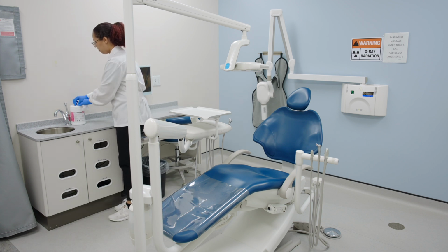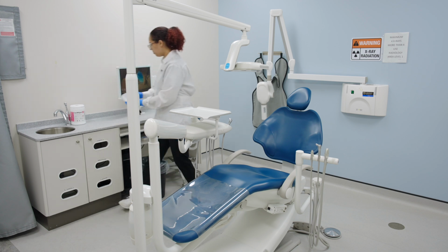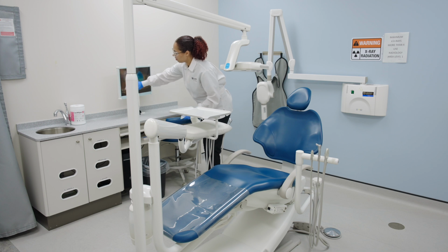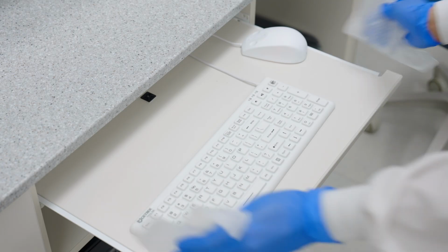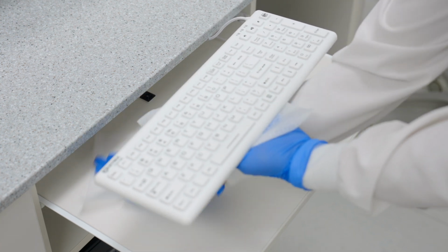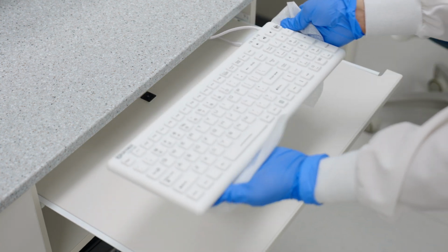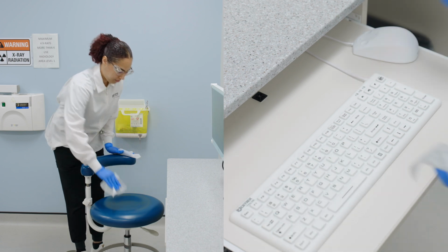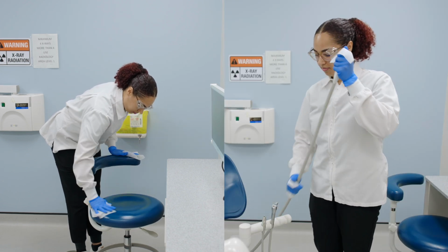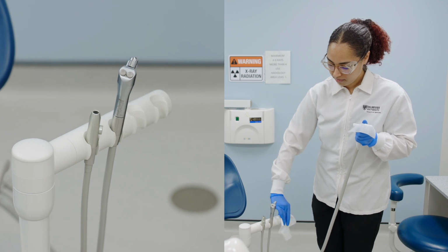Dispense a new CaviWipe and begin disinfecting the cubicle. Wipe from the cleanest surface to the most soiled surface to prevent cross-contamination. The following disinfection sequence is recommended. Ensure a fresh wipe is used when moving to a separate surface. Computer screen, keyboard, and mouse. Operator and assistant stools, including armrest, back, and seat areas.